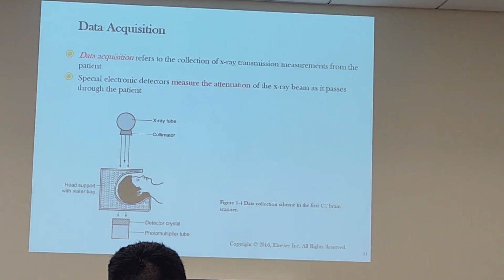So where does energy land? If we have a detector right here, and we have X-rays. We have bone, lots of bone. We have lungs, lots of lungs. We have some bone, and some tissue here. So we know X-ray is going to be stopped by what? Bone. Depending on the X-ray intensity or the energy, the frequency, it's going to get absorbed in bone.